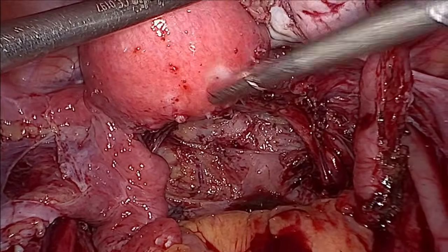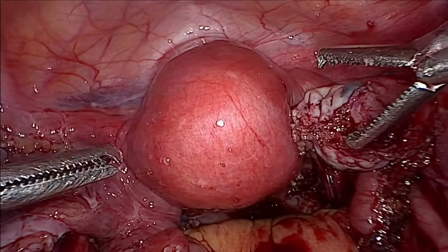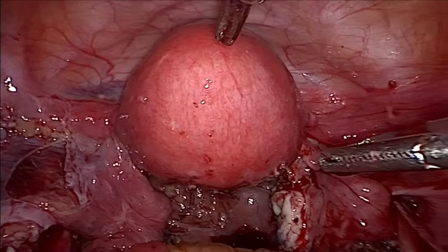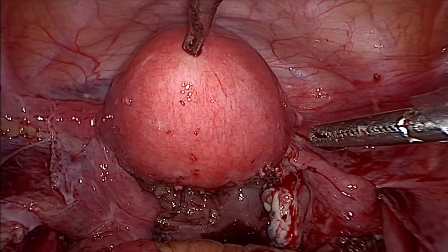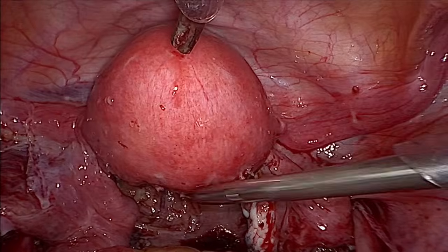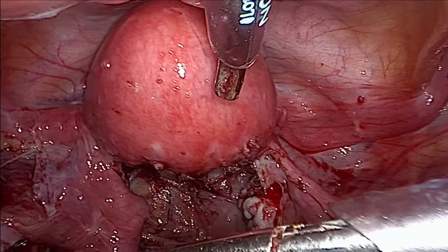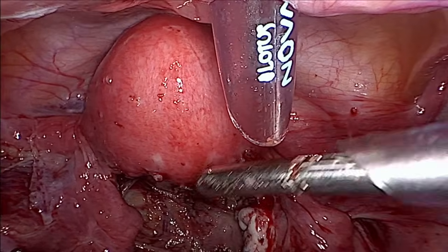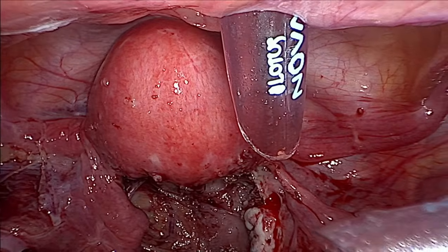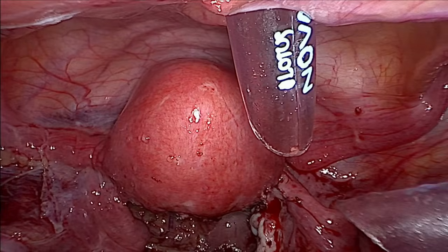Tanvi, you can show me your instrument. Is it here? Okay, so there is this small patch of adenomyosis, very small. Okay, we can just do a microablation there. Yeah, the probe is ready. And Tanvi, finally we will have a check of the tubes after doing the microablation.